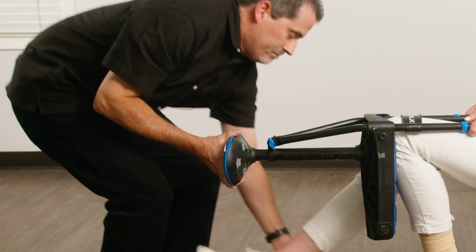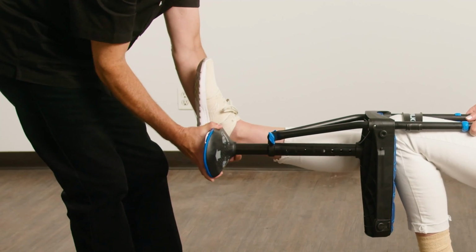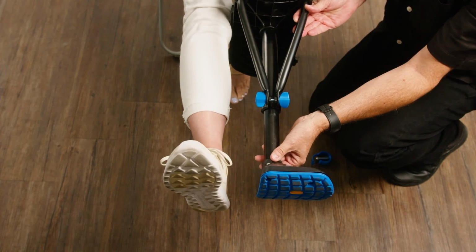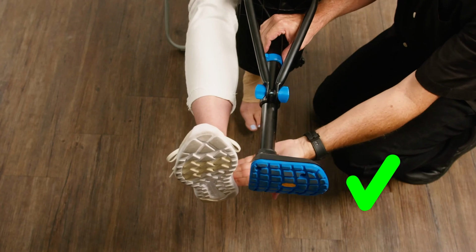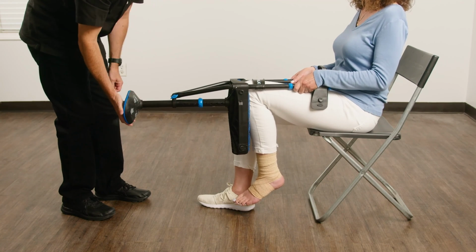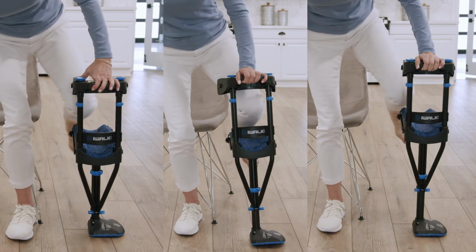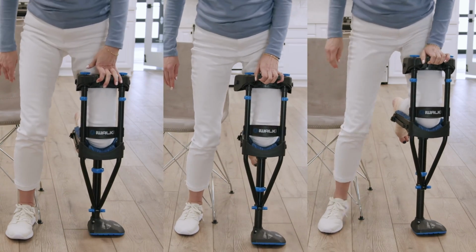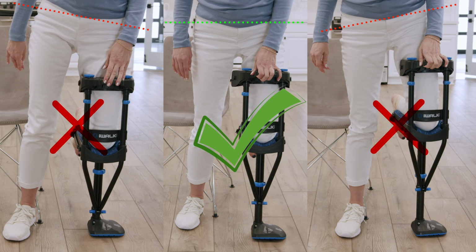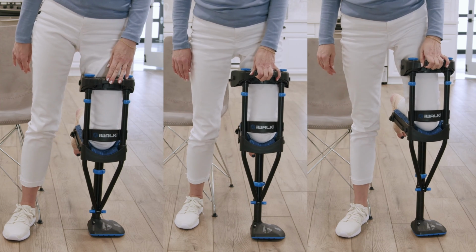Proper adjustment will place the bottom of the patient's heel level with the bottom of the iWALK foot. Lengthen or shorten the lower leg height adjustment until you achieve the right setting. Then reinstall the C-clip and tighten the clamp nut and bolt. Test your setting by having the patient kneel on the crutch. Weight must be distributed evenly between the good leg and the iWALK leg. The patient's hips and shoulders should be level. If not, readjust the lower height adjustment.